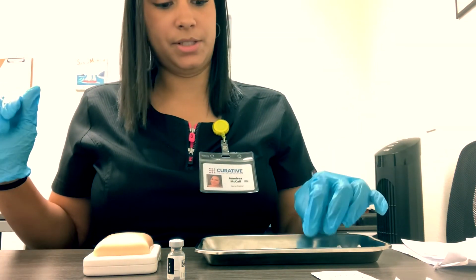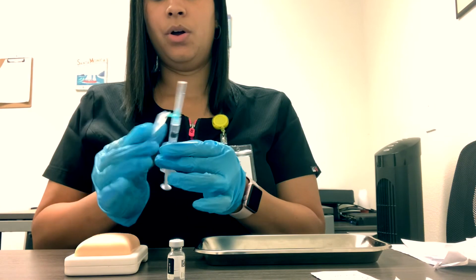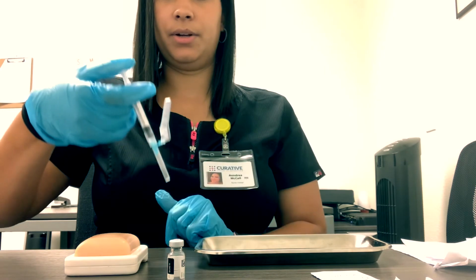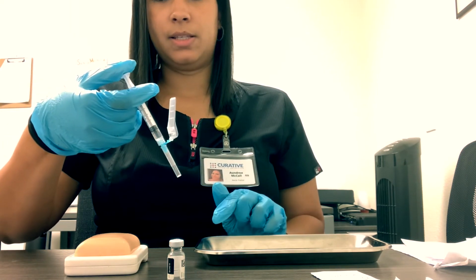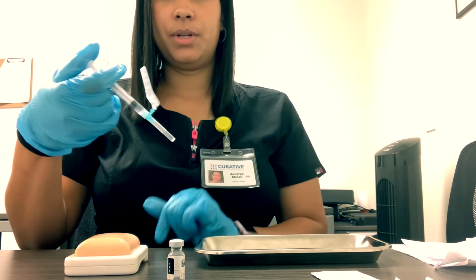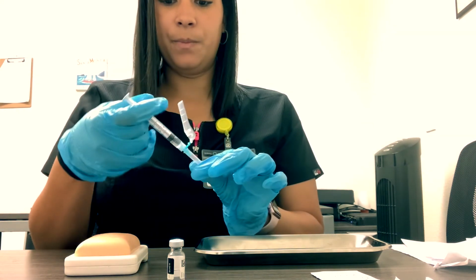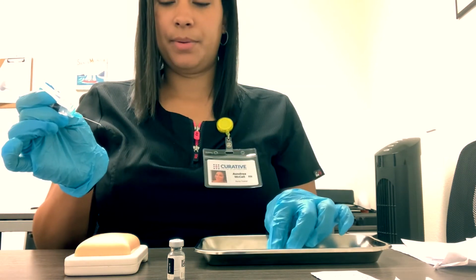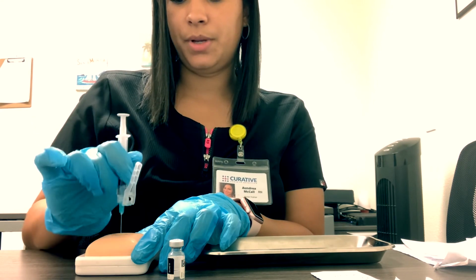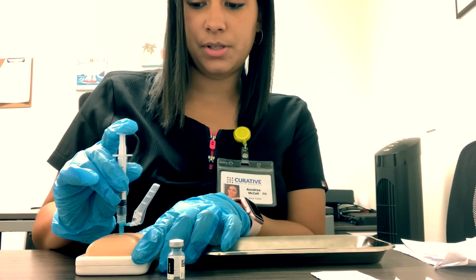Once we've cleaned our patient's skin, we're going to let it air dry. We're going to get our needle. We're going to use a dart method when we vaccinate, so we hold it here. We're not going to hold it here, because if we hold it here, we can accidentally spray out some of the vaccine prior to even puncturing the skin. Or if we hold it here, we can start pushing before we even get all the way into the muscle. So we'll go ahead and uncap. We're going to use a 90-degree dart method. So 1, 2, 3. Remember, this vaccine is viscous and it burns, so this one we have to push slowly.